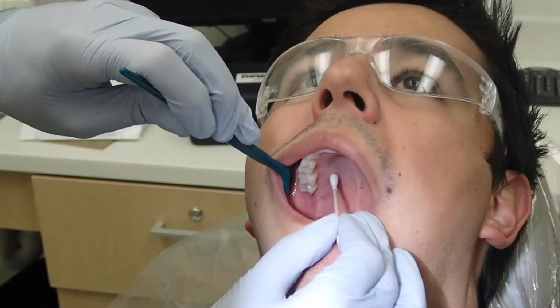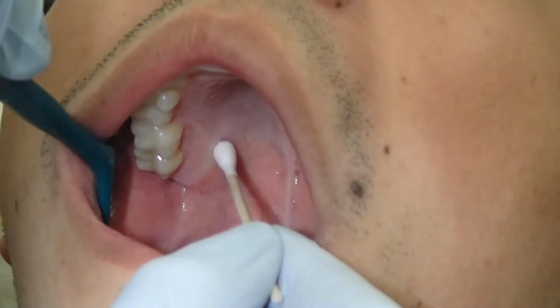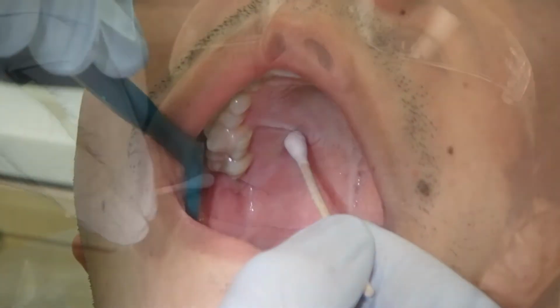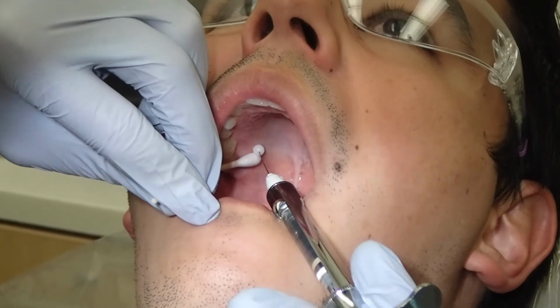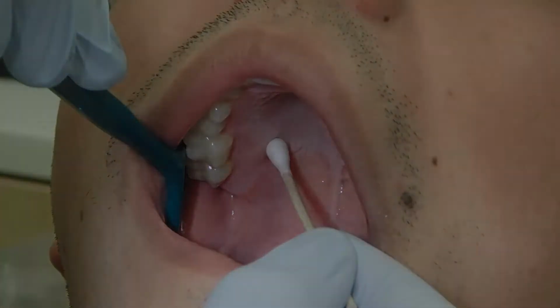The landmarks for the greater palatine nerve block are the border between the hard and soft palates and the maxillary second molar. This is typically where the greater palatine foramen is found, and your insertion site should be 2 to 3 millimeters anterior to the assumed location of the foramen. Gentle pressure applied with a cotton-tipped applicator, along with slow delivery, provides a more comfortable experience for the patient during needle insertion. A short 25 millimeter needle, along with minimal depth of penetration, are recommended to avoid trauma and subperiosteal delivery.